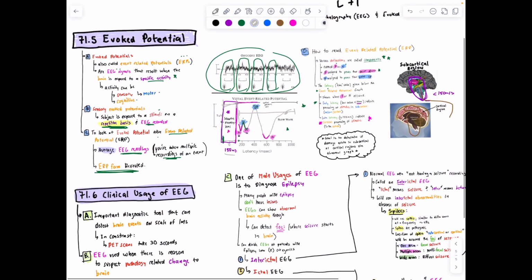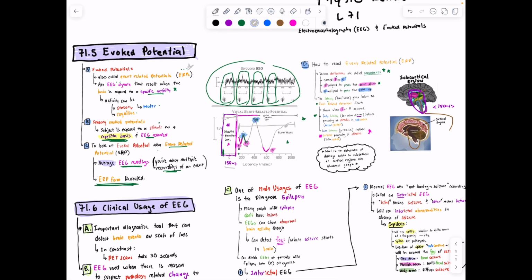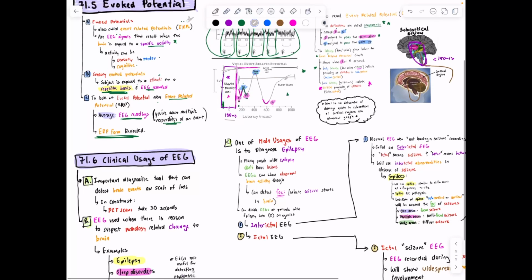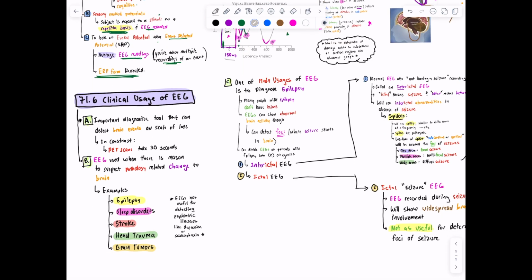So you combine it with the stimulus information in these evoked event-related potentials, right? You poke them, you're like, oh, this is poking them, versus, hey, move your arm. And it's like, oh, okay, well, something with the subcortical, him moving his arm, versus cortical processing of him moving his arm, it's a little bit different, right? So it's a diagnostic clue.